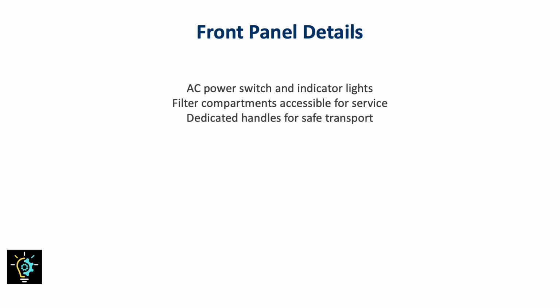Also, let's not forget the transport handles, something simple but vital in a busy ICU, where moving devices between rooms is routine. These design features aren't flashy, but they reflect practical engineering, making sure the device is safe, transportable, and easy to keep running without needing a full service teardown every time a filter change is due.